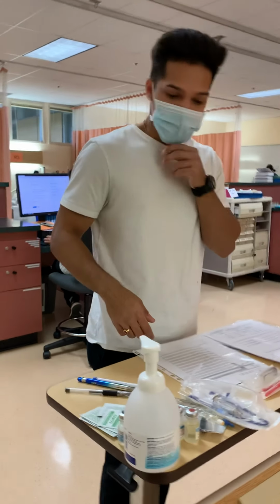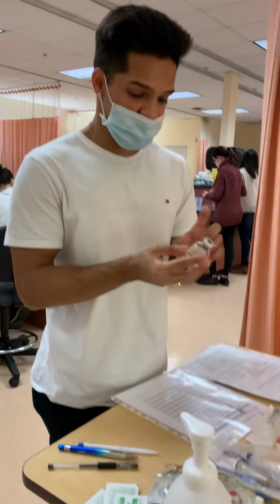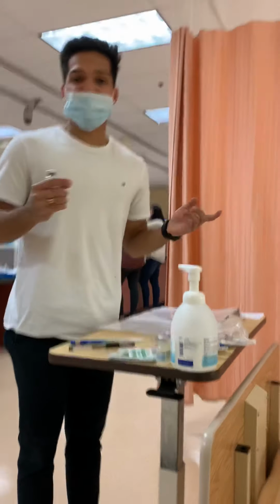I'm just going to be doing hand hygiene and pulling out my medications. And over here I have my cloxacillin. It's not damaged or expired in any way, so it's good to use. And now I'm going to do my first actual check.